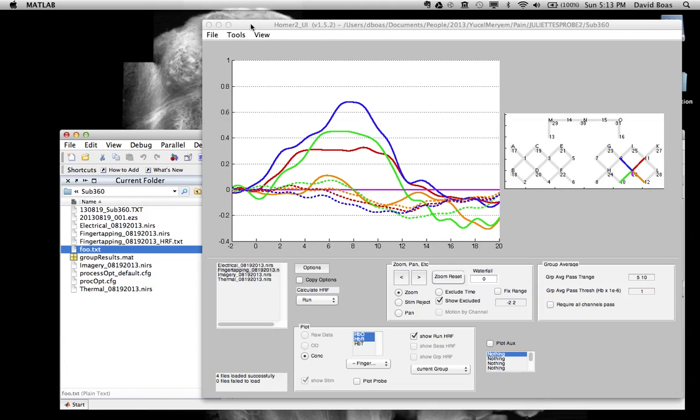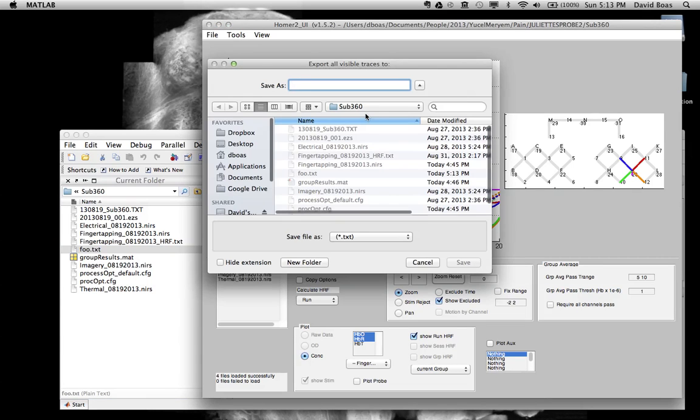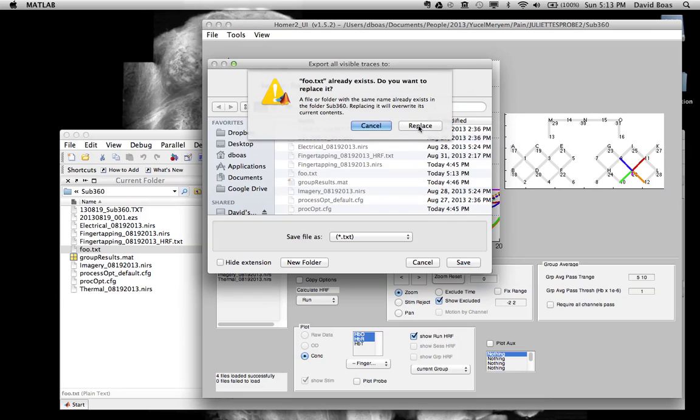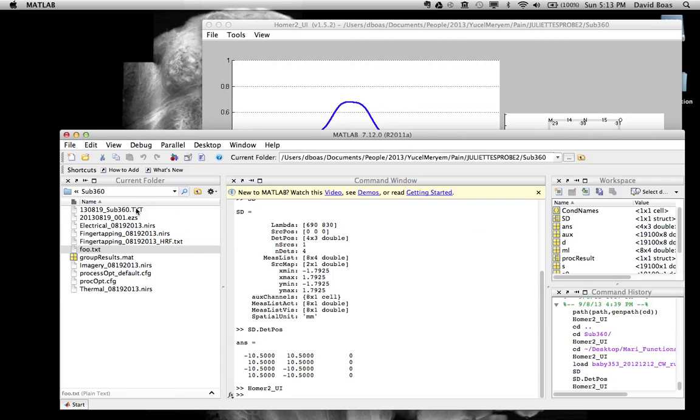We can go back. Let me show you what it looks like if we export all visible traces into the same text file. And replace it. Open this up.